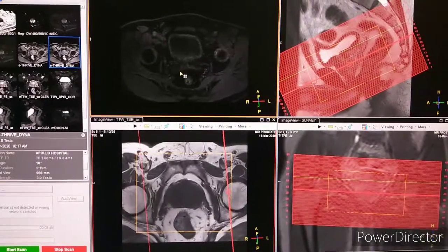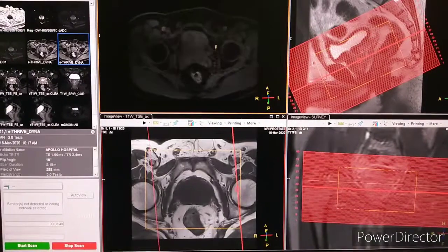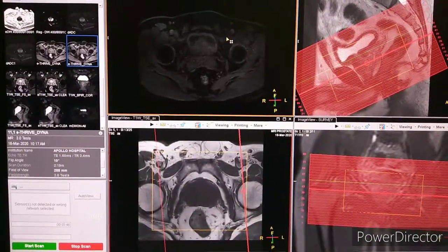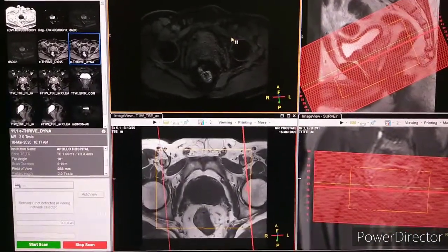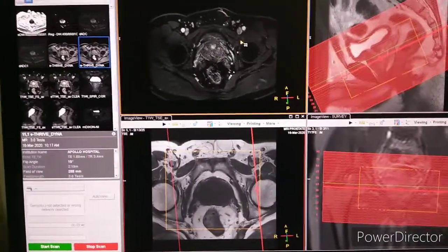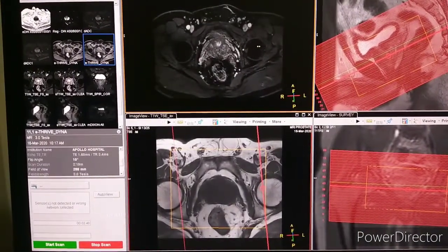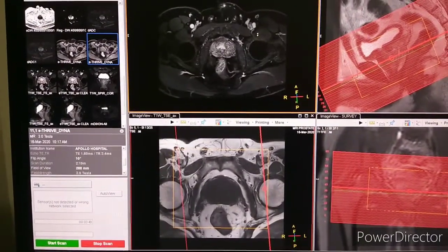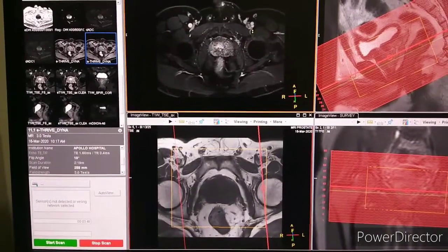Now the dynamic scan. We have taken most of the pelvis area for the dynamic coverage. We acquired 8 dynamics in total: dynamic 1 through dynamic 8. After dynamic 1, we have to start injecting contrast and simultaneously start the scan as well.